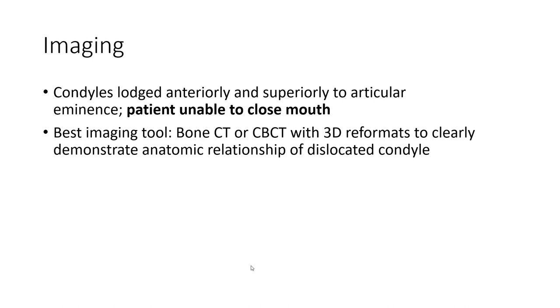The condyle lies anteriorly and superiorly to the articular eminence, and the patient is unable to close the mouth. The best imaging is bone CT or cone beam CT with 3D reformation to clearly demonstrate the anatomic relationship of the dislocated condyle.